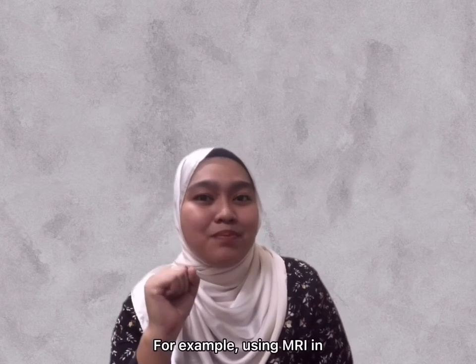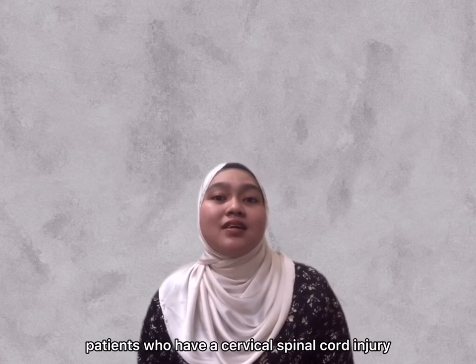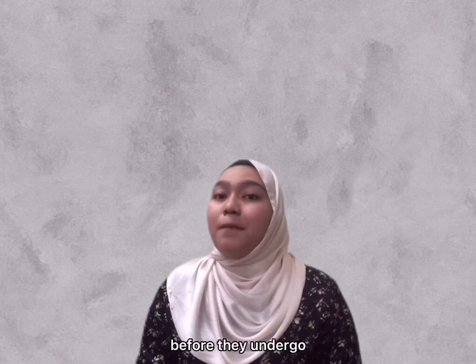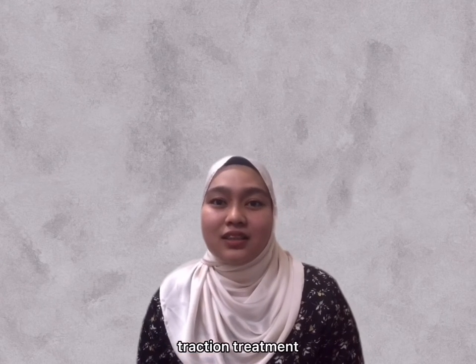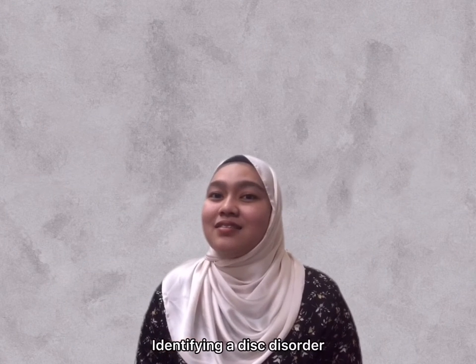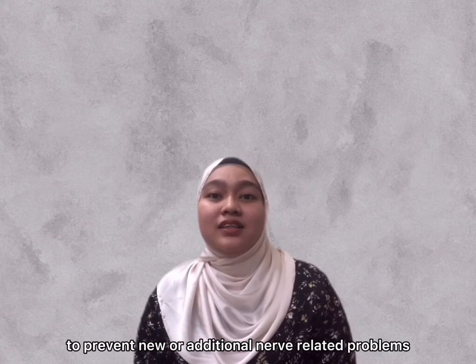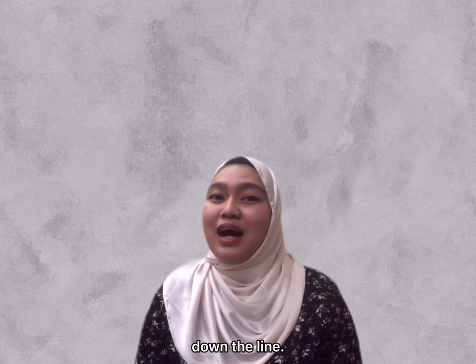For example, using MRI on patients who have a cervical spinal cord injury before they undergo traction treatment allows the doctor to see a possible disc bulge or herniation. Identifying a disc disorder before traction may help to prevent new or additional nerve-related problems down the line.